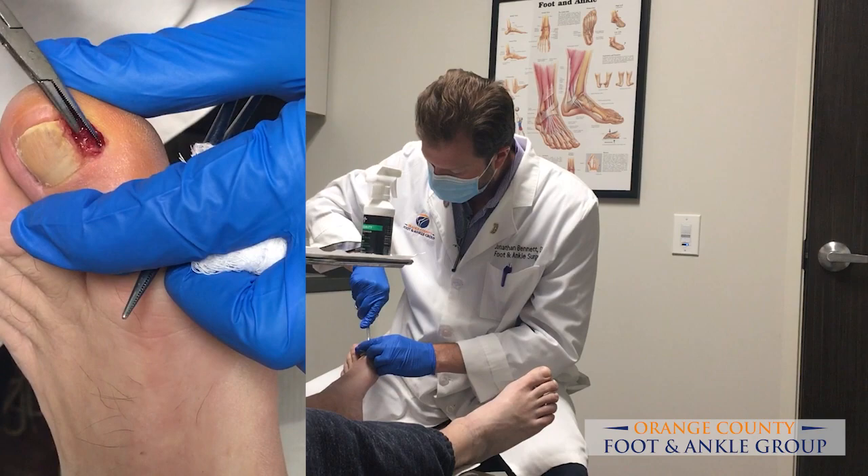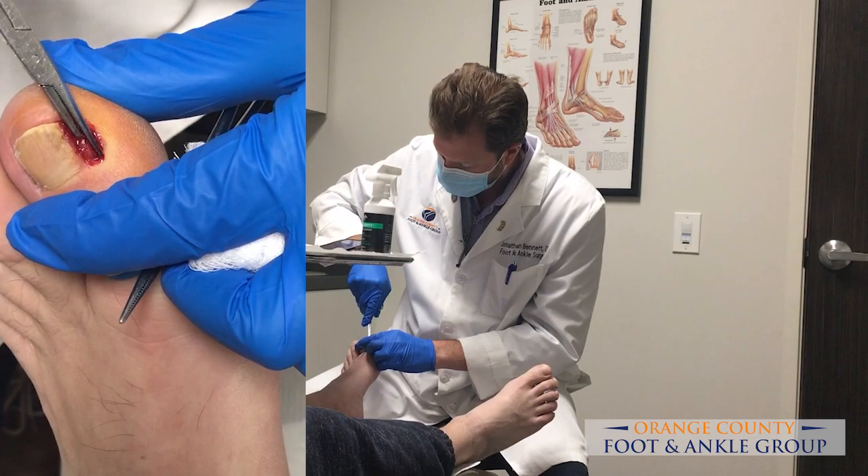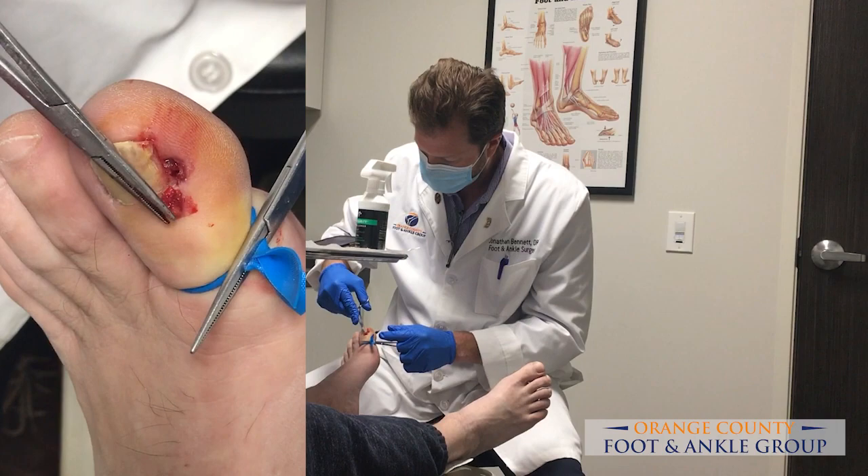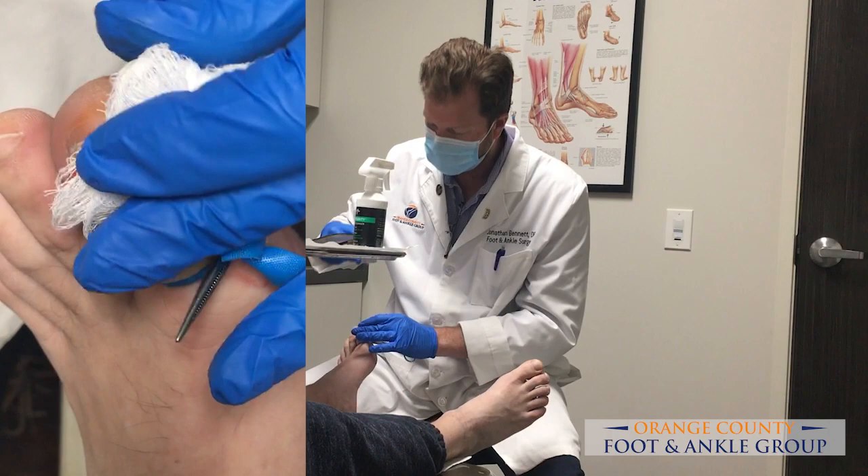You can see how big that is. So we pulled out this little piece. You can see that it was all buried underneath his skin and causing him this recurrent ingrown nail and pain. So that's out.